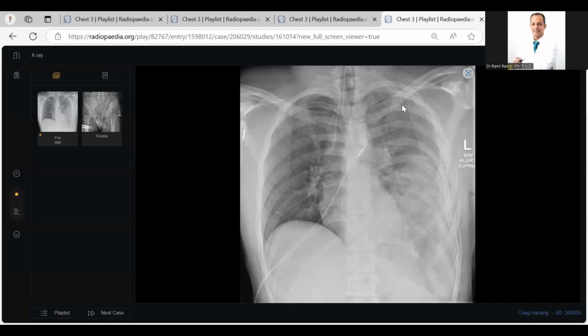What will you do next? If the patient is stable, and after informing the clinical team, I would suggest contrast-enhanced CT chest and abdomen for further evaluation. What are you worried about? Sir, because there is a suspicion of a left diaphragmatic rupture.